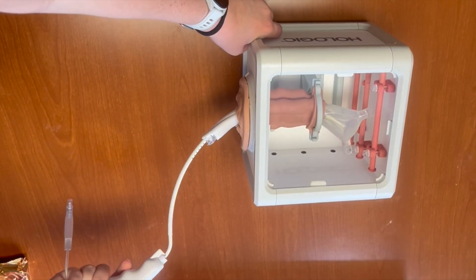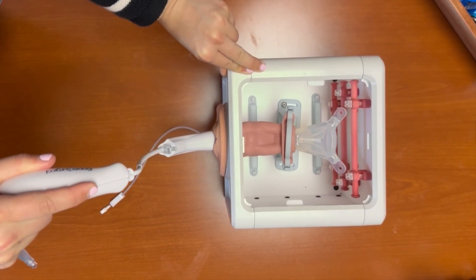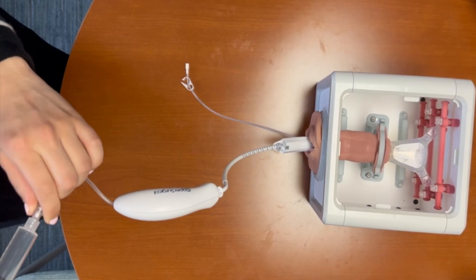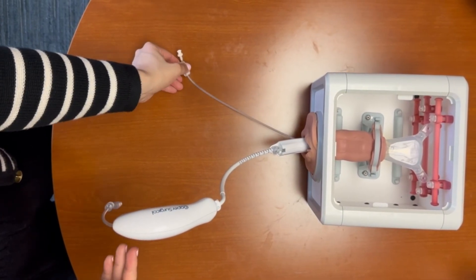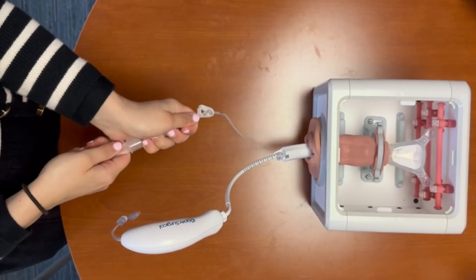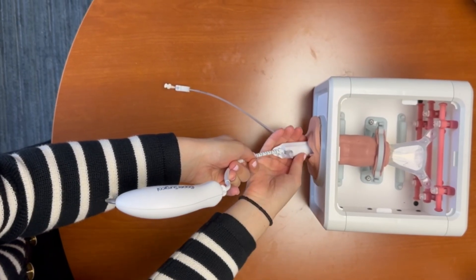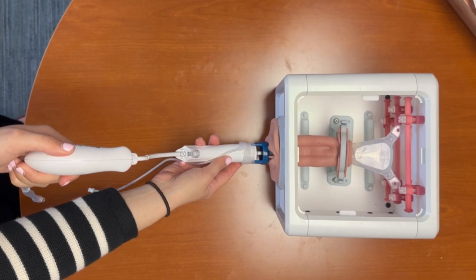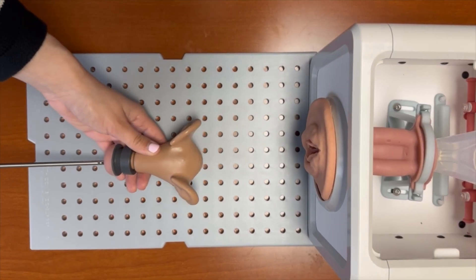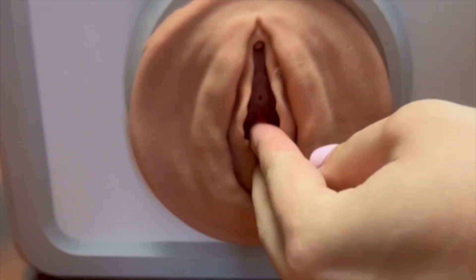Twisting counterclockwise rotates the uterus to the patient's right, while twisting clockwise rotates the uterus to the patient's left. Moving your hand to the opposite side may allow for further lateral displacement. Dropping your hand will antivert the uterus, and elevating your hand will retrovert the uterus. To remove the device, deflate both balloons, unlock the device, slide out the cup, and remove the Delineator. We can then grasp and remove the uterus. We will then reinsert and inflate the vaginal balloon in order to maintain pneumoperitoneum.